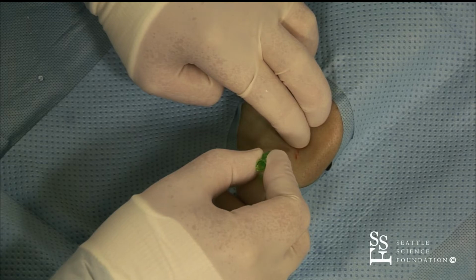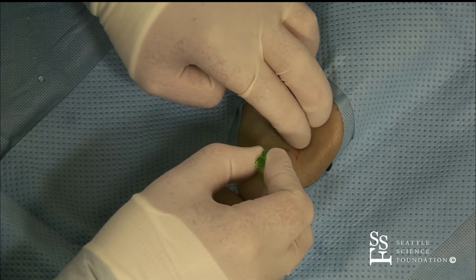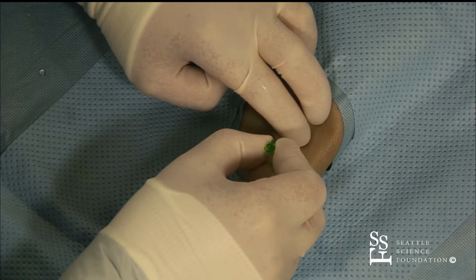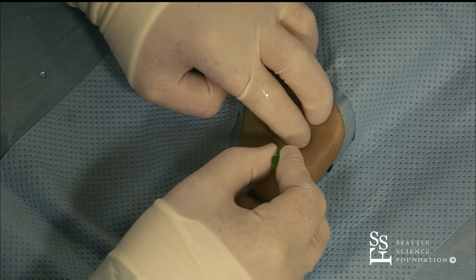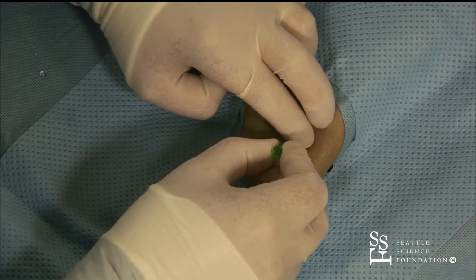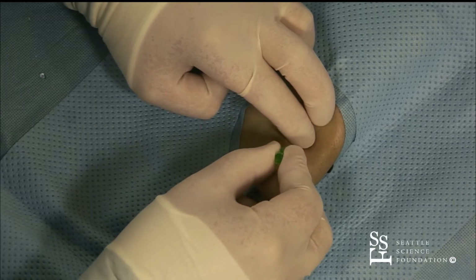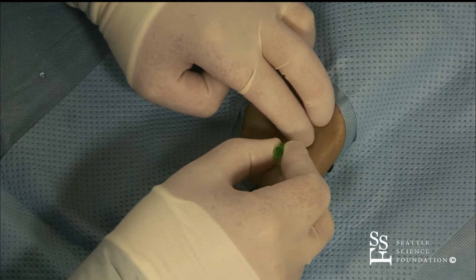So that's a Cook needle. It's nice, and the other brand that you can find is the Argon needle. It has a 2.5 centimeter length, or 1 inch. They come in 2 inch for micropuncture or 1 inch. It's much better to use a shorter one because you can see the pulsatile flow more easily. You don't really need the long one, because it's a little bit more difficult to manipulate.